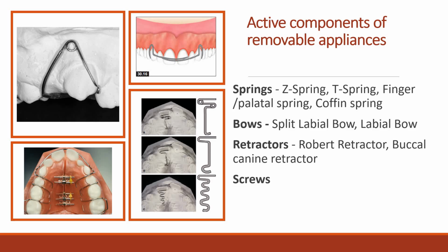Let's consider the components of removable appliances. Removable appliances are composed of retentive and active components connected together by a base plate. When designing a removable appliance, consideration also needs to be given towards ensuring that the desired teeth will move under the active force applied by the appliance.